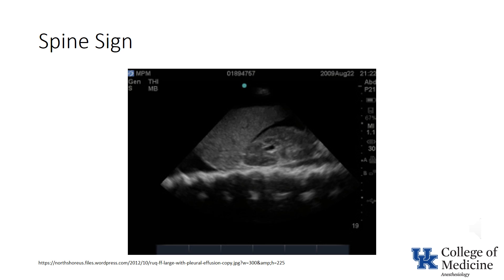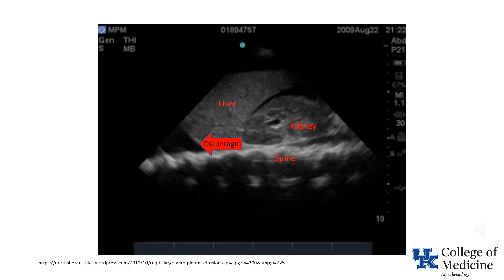Next, we'll talk about the spine sign. Here's an abdominal ultrasound showing the diaphragm, liver, and kidney. Normally, presence of air in the lungs results in the inability to visualize the spine above the diaphragm. However, this image clearly shows the spine both above and below the diaphragm. The ability to see the spine above the diaphragm is indicative of the fact that something which transmits ultrasound — most likely fluid — is located above the diaphragm.